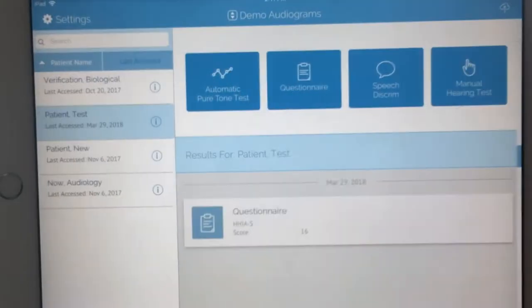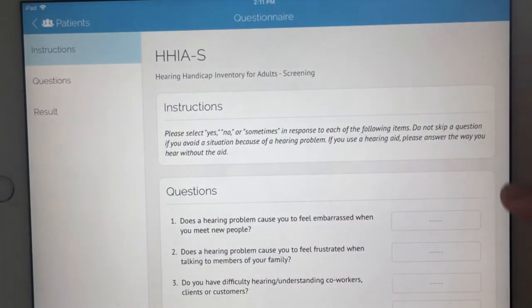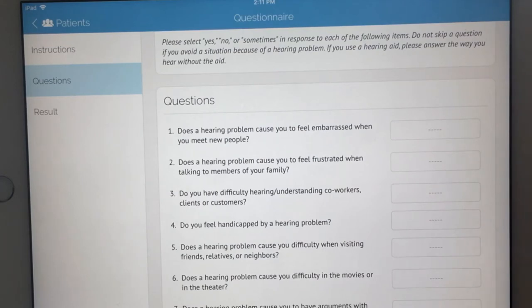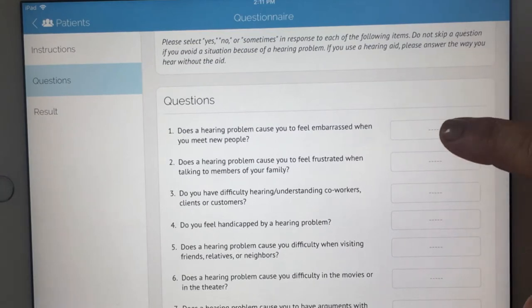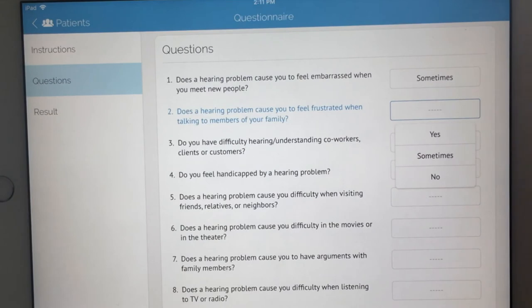In order to go in and select this for a patient, we would select the questionnaire. You'll see here there are some brief instructions and a drop-down menu for your questions. You can select whether or not to pose the questions verbally to your patient, or you can also hand the iPad over to them and have them read the questions themselves. This can be especially helpful when you're interacting with someone with significant hearing loss. By selecting the answer box here, you see that it's a closed set answer group from yes, sometimes, and no. Very easy to go in there and select your answer, and it automatically prompts you to that next question.